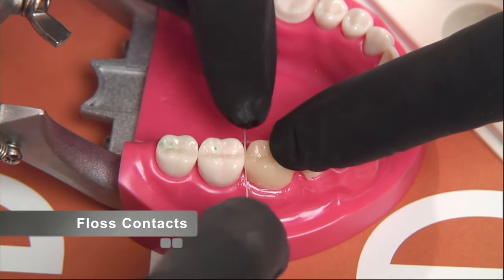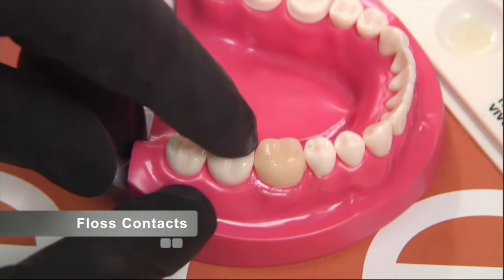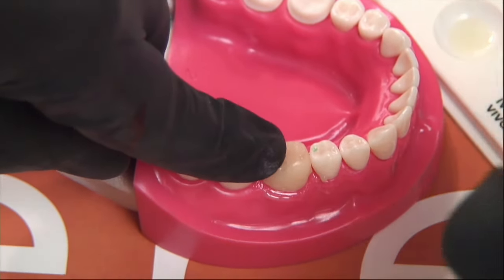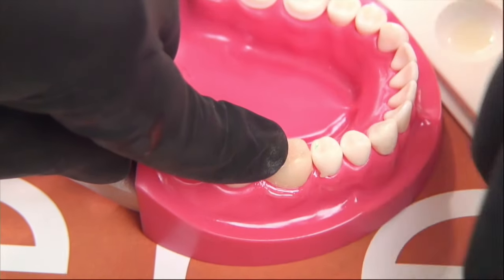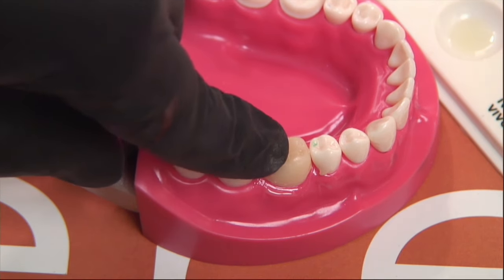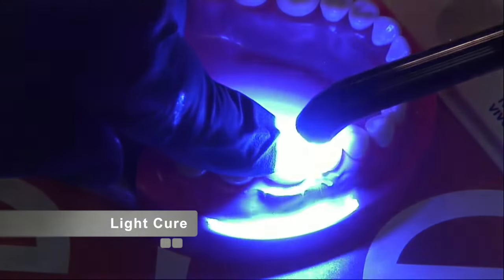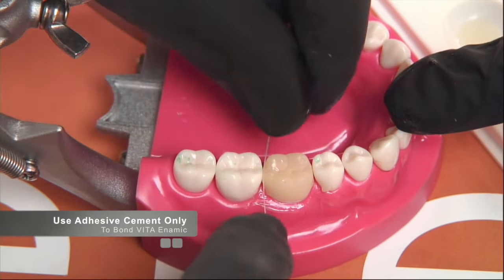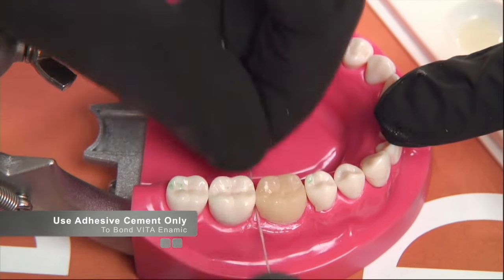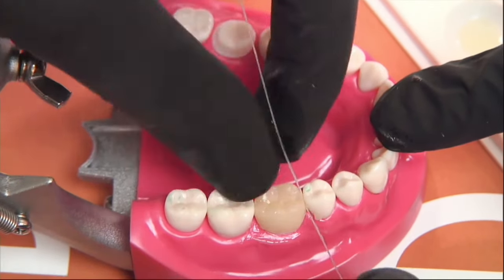We're going to floss the distal contact while holding the restoration down, then floss the mesial contact. Once you hold that restoration down, try not to let go — you don't want the restoration to unseat. Once excess cement is cleared off, we do the light cure. With that light cure the restoration is complete. We can now verify that contacts are open, and the process is no different than cementing any other material.